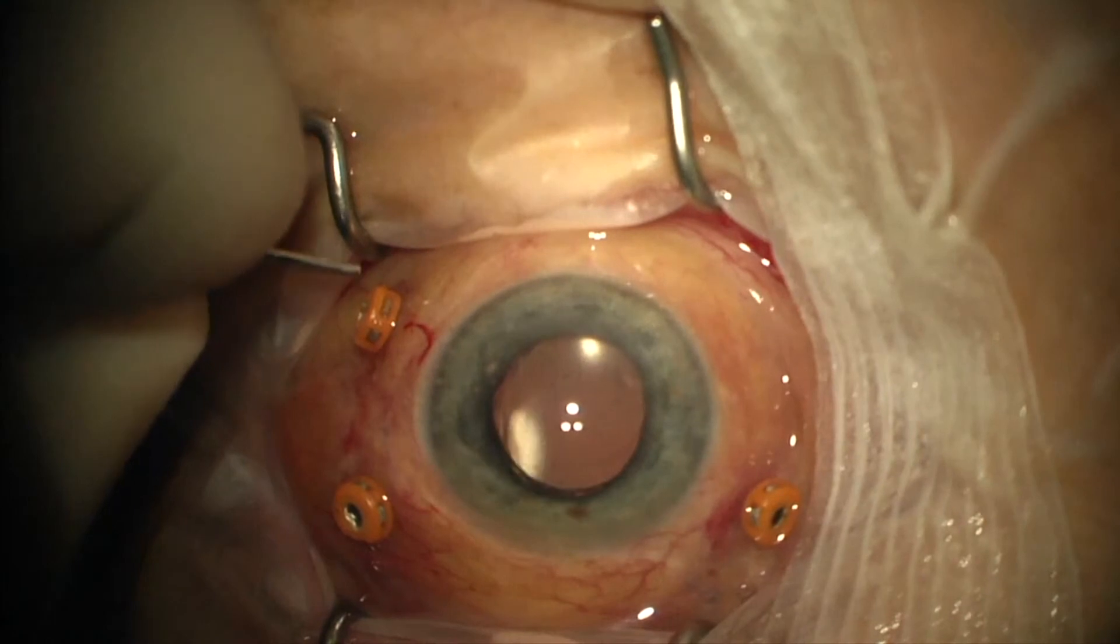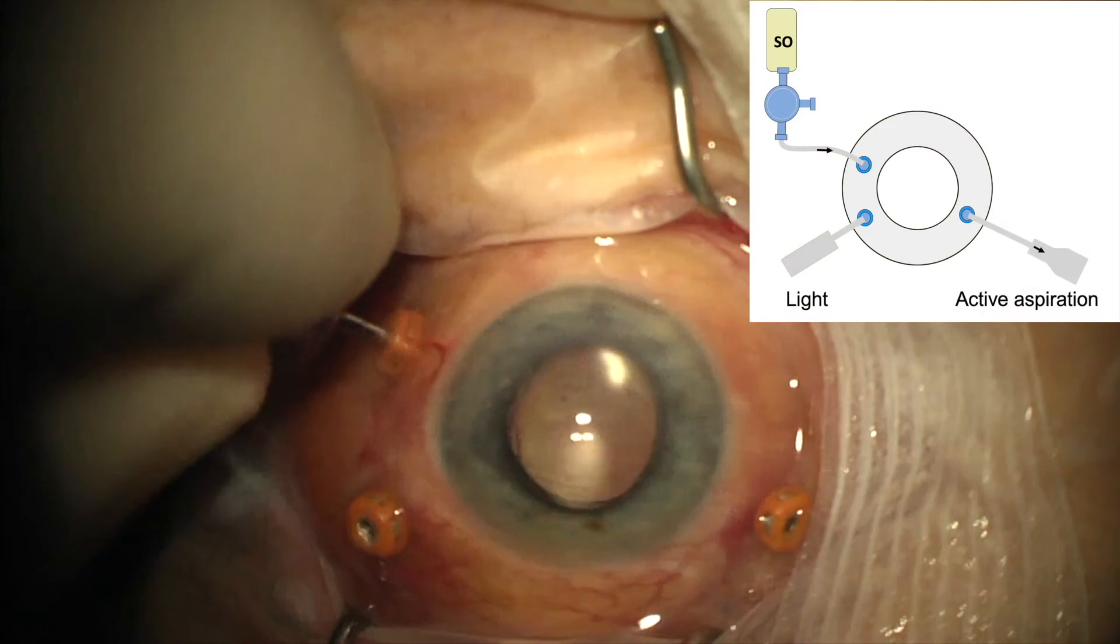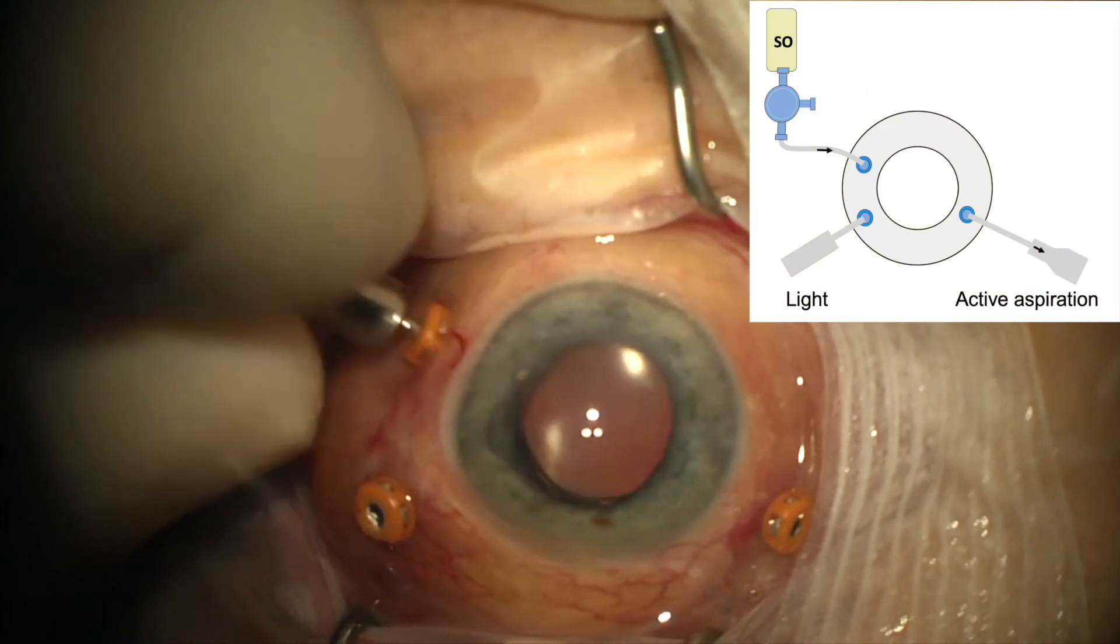The photograph insert shows the rest of the setup with the active extrusion and the light pipe inserted through the superior trocars.